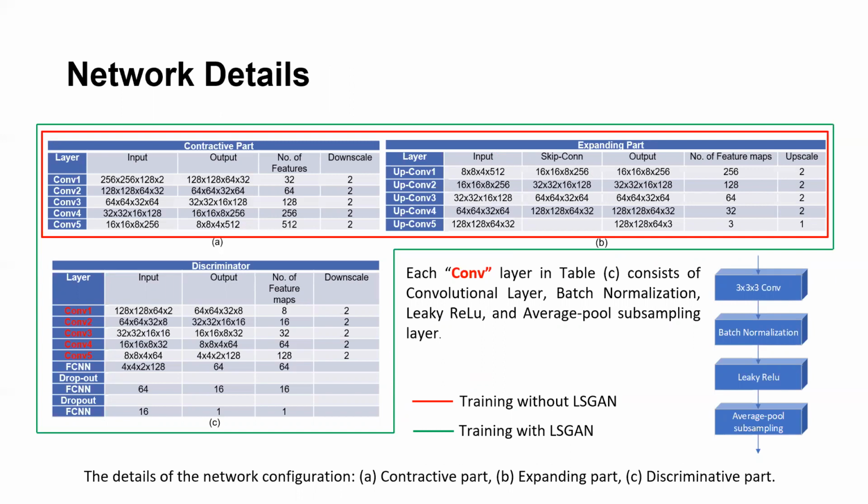You can see that the network input consists of 2 channels, which is basically the concatenation of the moving image volume to the fixed volume. The output of the generator is a volume of 3 channels, which represents the deformation field or the displacement field for the X, Y, Z components of the displacement vector.